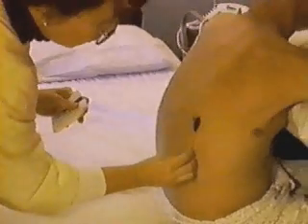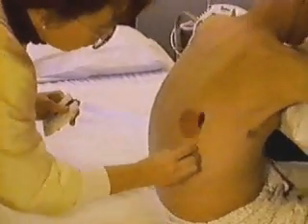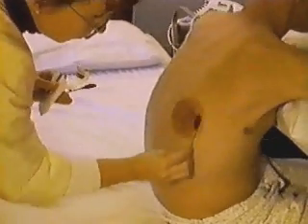She marks the site. The operator then cleanses the area with antiseptic solution, applying it in a spiral pattern outward to avoid passing from dirty areas to clean. She makes three applications.